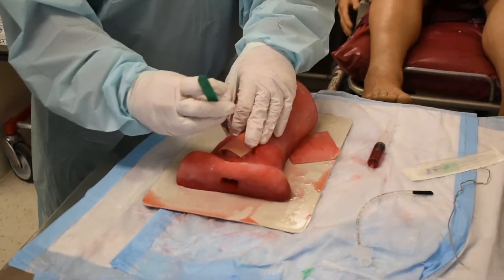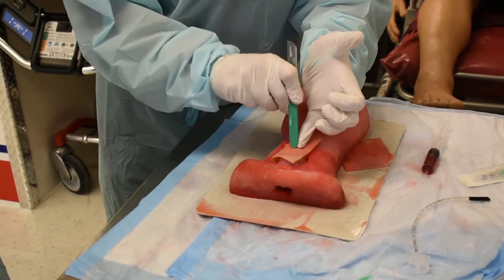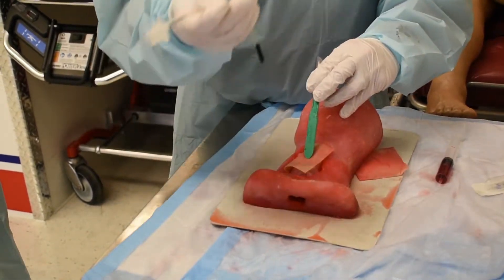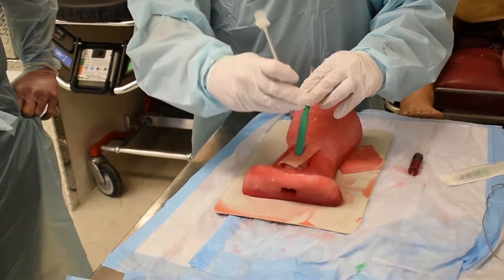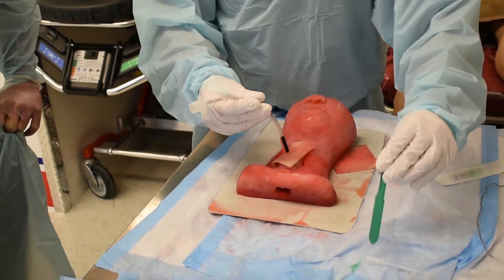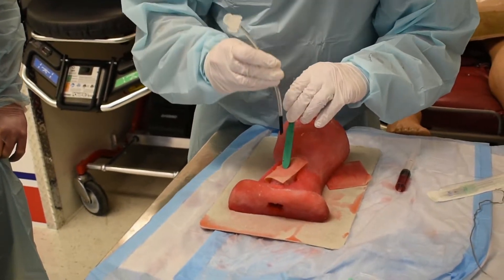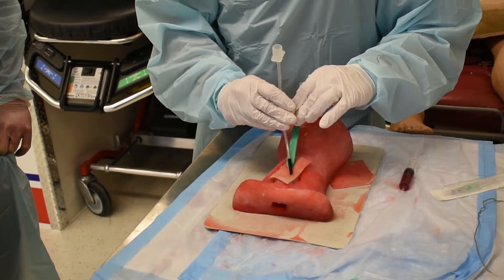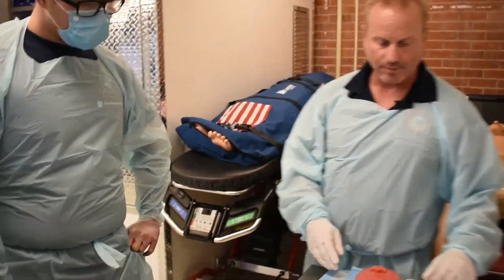You can use a cric hook if you want. Once you make the incision big enough, you can shield your scalpel, flip it around, put it in and angle it down towards the trachea. When you bank your tube off that, it's only going to go one way — you can never accidentally retrograde them. Just be careful: if you use a bougie or a trach hook, don't go straight down because you can actually puncture the bougie through the trachea through that little mucosal area.